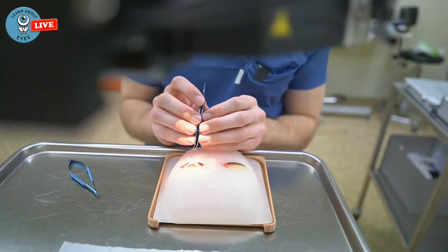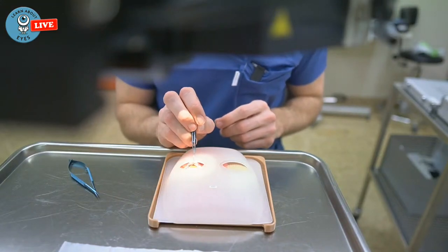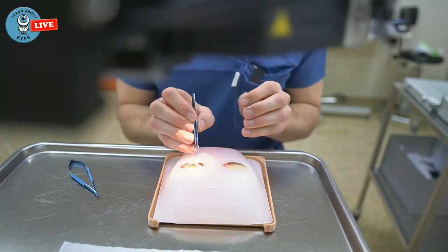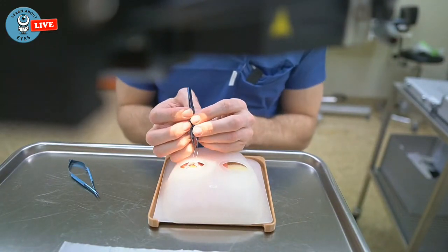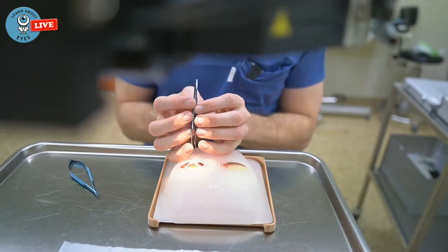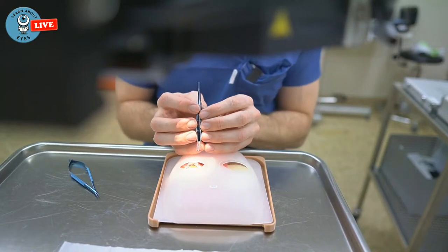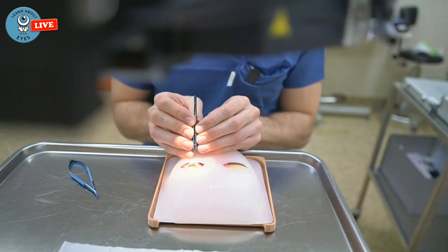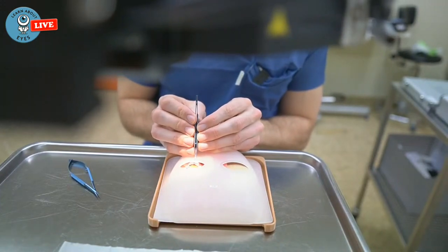For beginners, as a good tip, instead of just using one hand to lead the forceps, I think it's pretty good, because you're usually shaking a bit if you're just using one hand, to use both hands. Then you can use your palms or your little fingers to rest on the patient's forehead. And then you can just put your forceps in like this, and then you can rotate it this way with all your fingers.